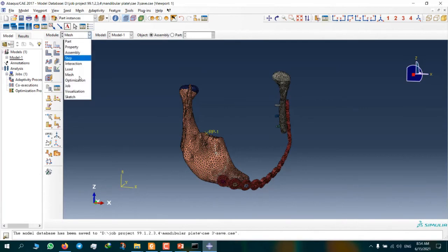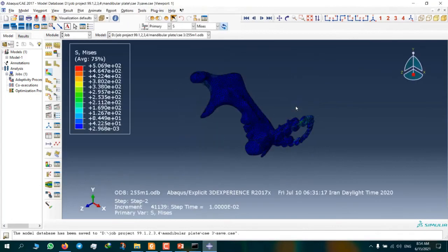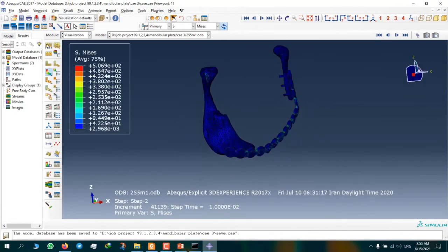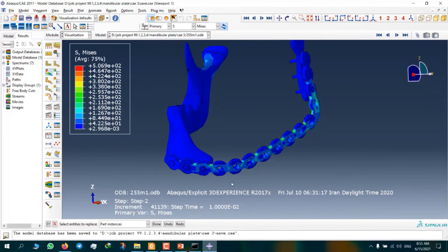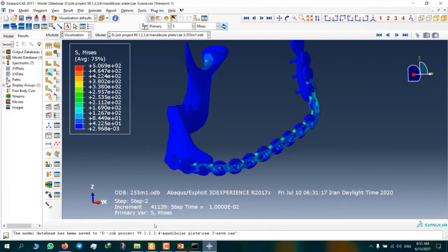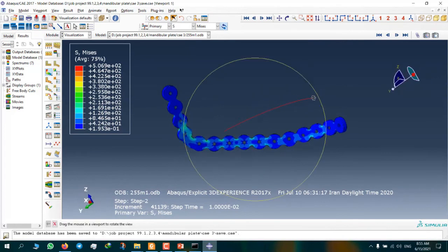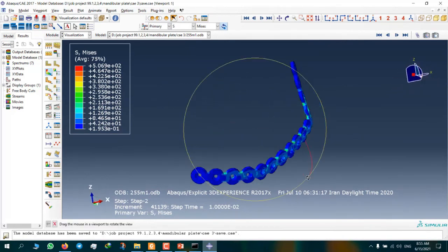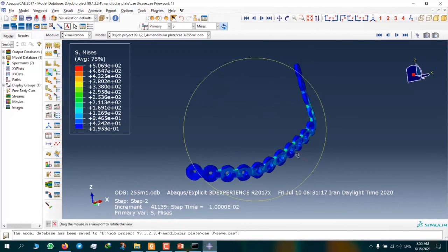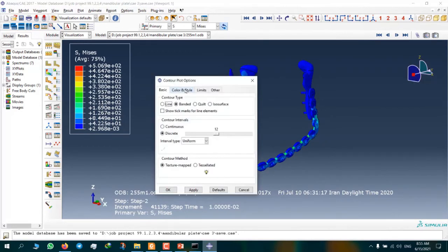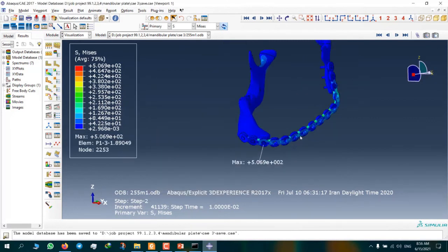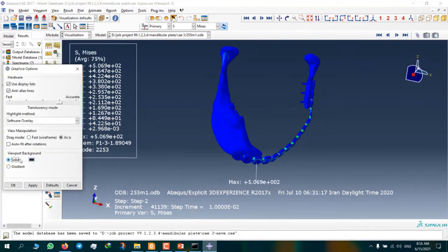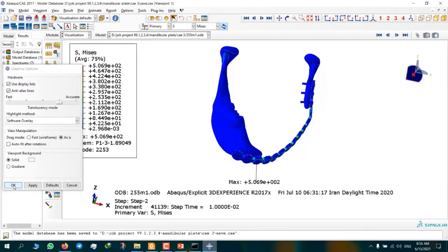Now we can go to results. Here we have the results. You can see a mandibular plate for the stress analysis. This is for maximum stress location. This is for maximum stress.